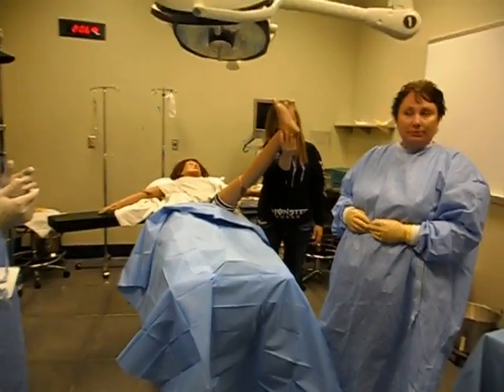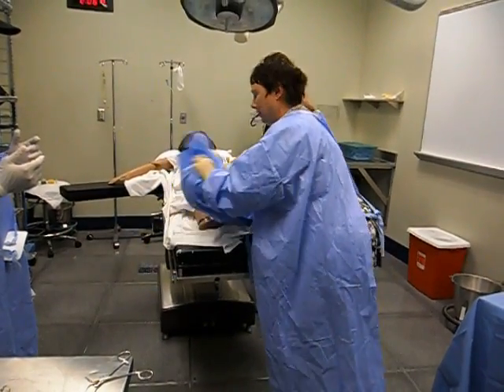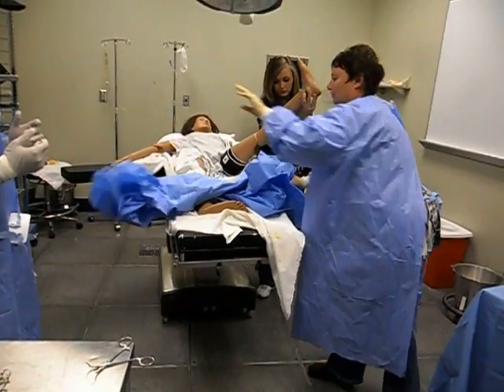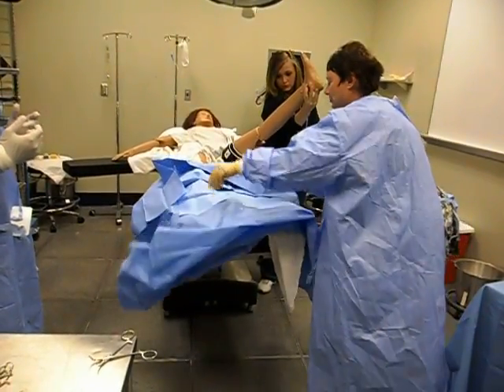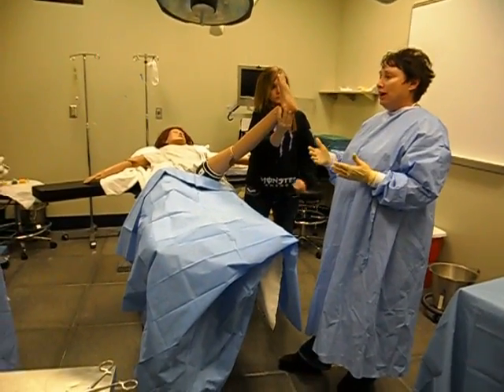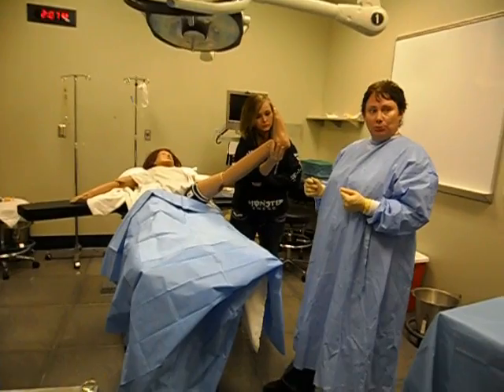Another way to do it — remember how table drapes come all fan-folded and then folded up? Hold it towards you and then up. So there are a few ways to put this sheet on; the easiest is if you have somebody there to help you. Next, remember we're going to put a towel around the tourniquet. The tourniquet is unsterile, and we're going to put a sterile towel around it to sort of protect it.